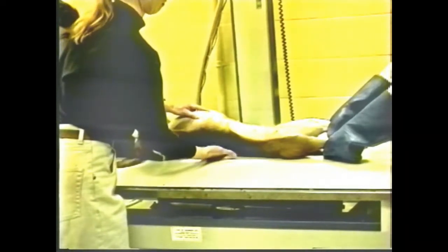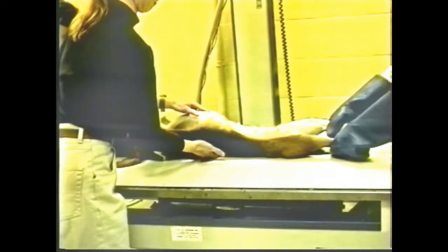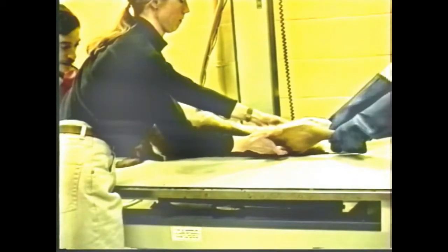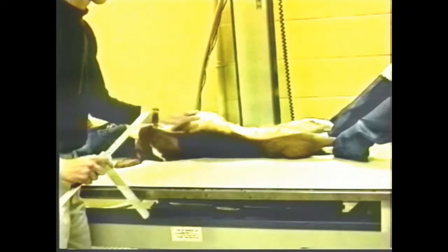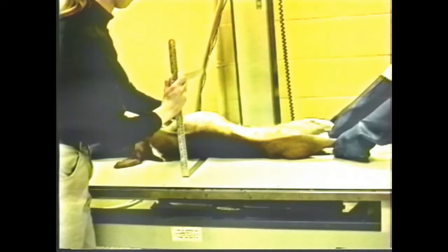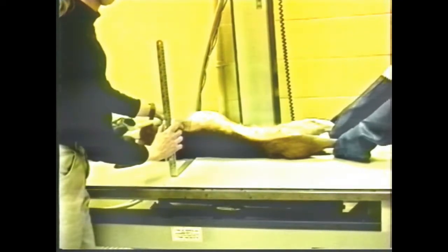You must use the same positioning for a VD abdomen as we did for the thorax. The forelegs must be pulled cranial and control the head between the legs, and the VD of the pelvis must be accurately positioned. The animal is measured over the greatest depth of the cranial abdomen, which is at the last ribs.